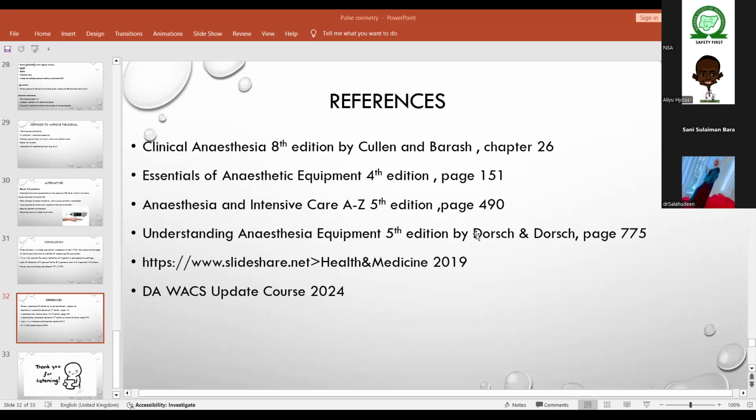Okay, so another question from the chat box. Yes, which is the last question from the chat box. It's from Ryan Yusuf. He said, thank you for the presentation. You want to know what is isobestic point? Okay, isobestic point determines the hemoglobin concentration regardless of the saturation.